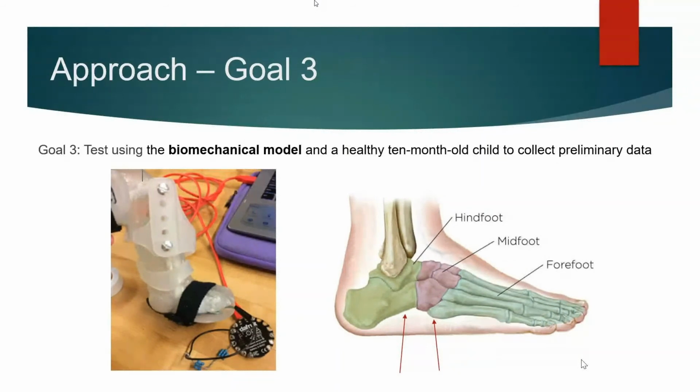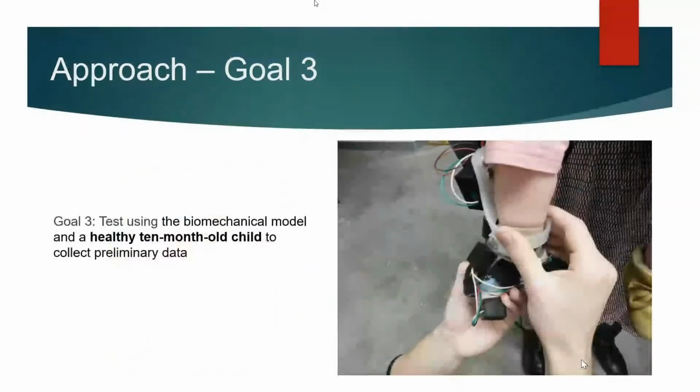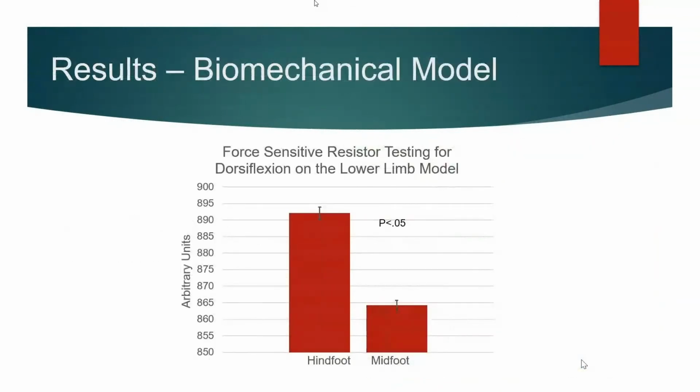Then we also completed the other half of our third goal by bringing in a healthy 10-month-old child to test the system. For this test, we had the parent hold the child while the child wore the brace with all 4 sensors that I previously explained for about 4 minutes of testing. I would now like to show you the results from these 2 tests.